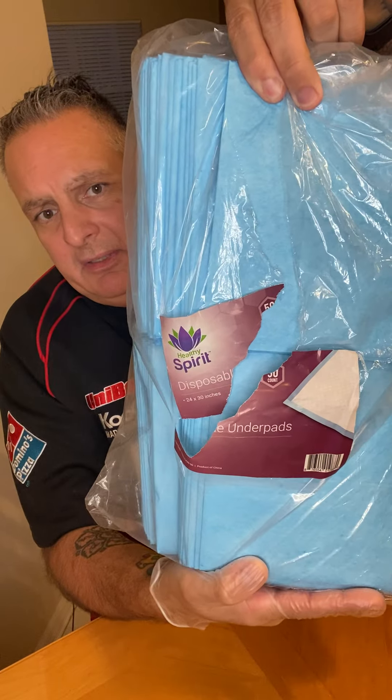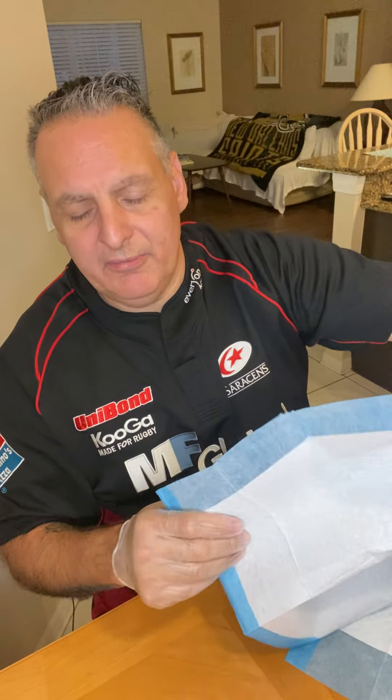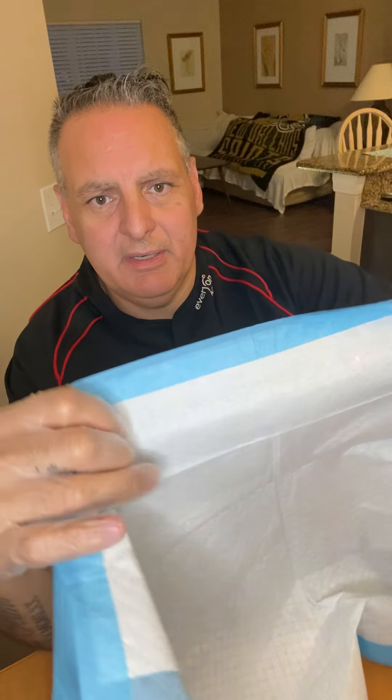The next item is the under pads. These are the Healthy Spirit disposable under pads — they come in a big pack. These just came in; this is my third or fourth of these. They come in a count of 50, and they are leak proof. The plastic side goes on the bottom onto the bed, and this is the part that the person would be laying on. The size is 24 by 30, so it covers a nice area of the bed.